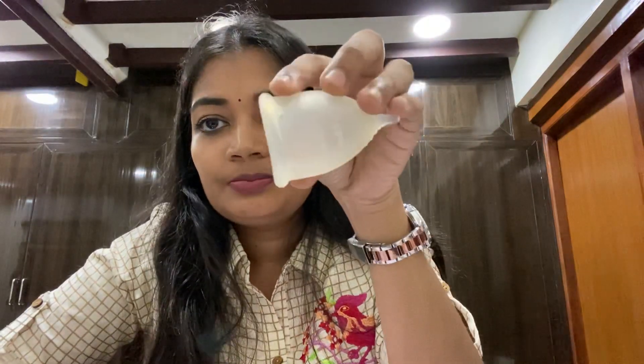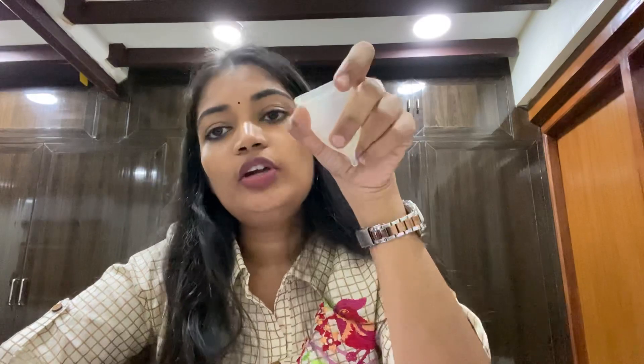This is a menstrual cup. For everyone, it is a substitute for pads and tampons. It is also environmentally friendly.